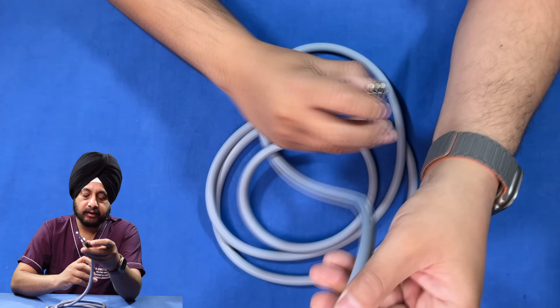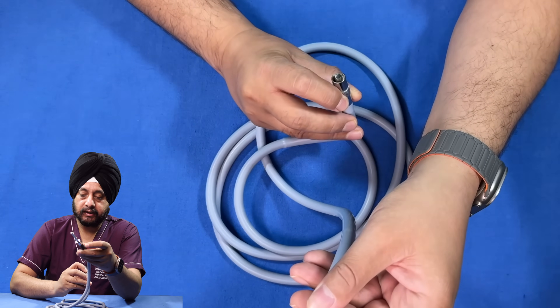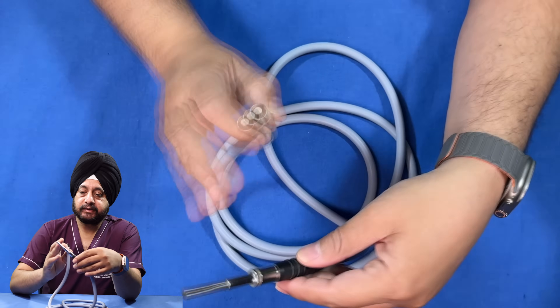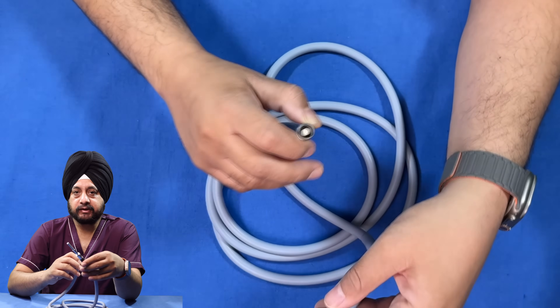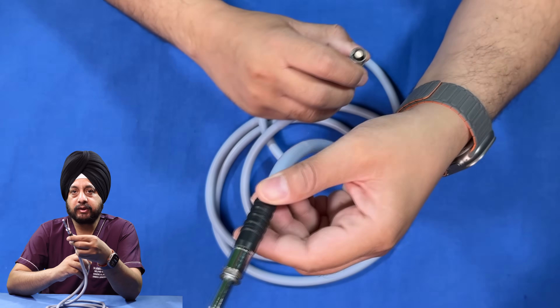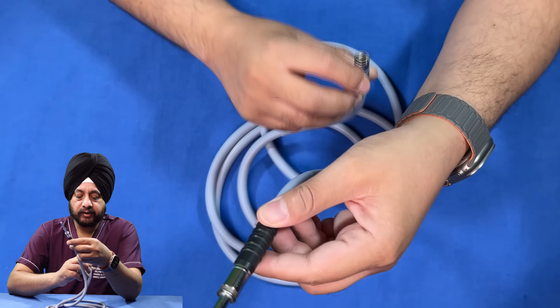To test the cable, you can point this end towards a light source — in this case we have a light here — and then see the output from the other end. Do not look at it when it is connected to an actual light source, because that might be too bright for your eyes. Simply point it towards the OT light and observe from this end.